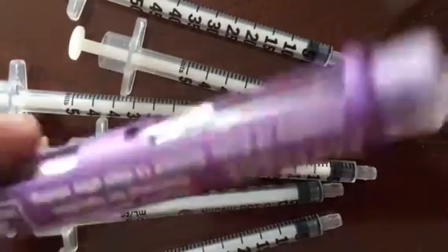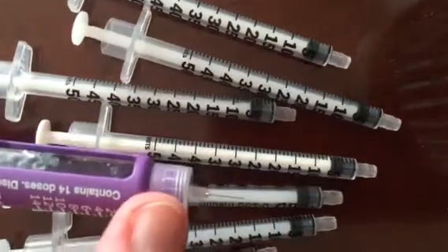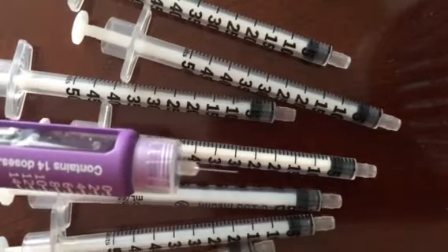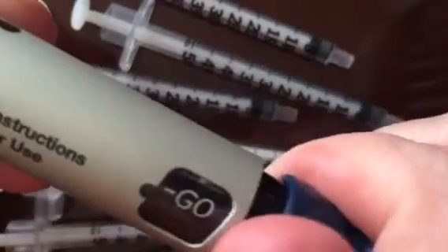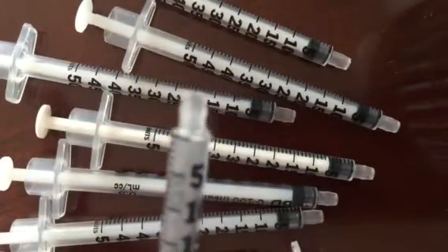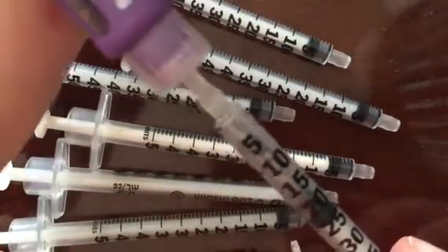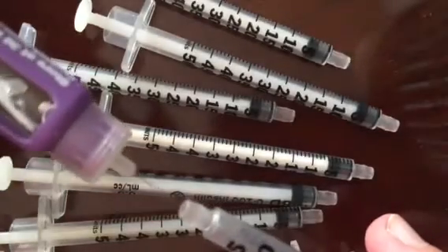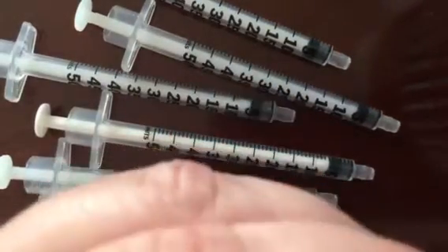All right, just for knowledge, the needle length on the NatPara needles that they send is the same width and length as the syringes that I would be using if I used the insulin syringes. So I'm going to dial in a full day's dose, and then I'm just gonna insert the needle and push the medication in. Push the medication in. So that would have been one complete dose.